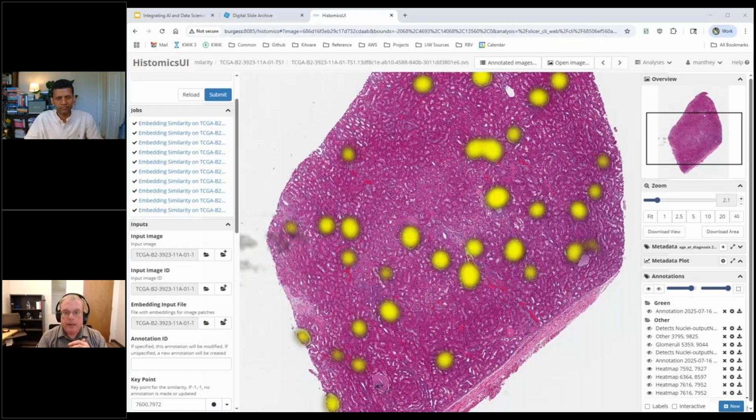And there are different ways to tie that in. We could have passed into our model the metadata we had. You could have passed in a pathology report that you had adjacent to this. What we pass into the model can be as rich as you want, and what we get out can be any form of annotation. Here we're doing a heat map annotation, but we could have done perimeters to find boundaries. We could have done a write-up where it gives you a verbal, textual description of what you see. All of that's quite straightforward to do, and it's just a matter of where you want to see it.